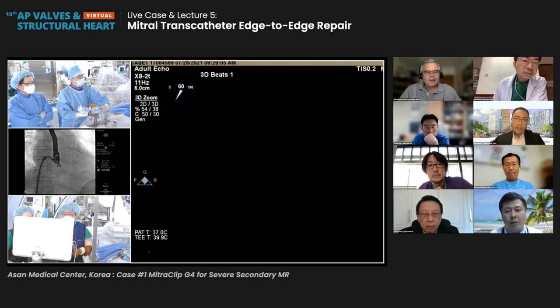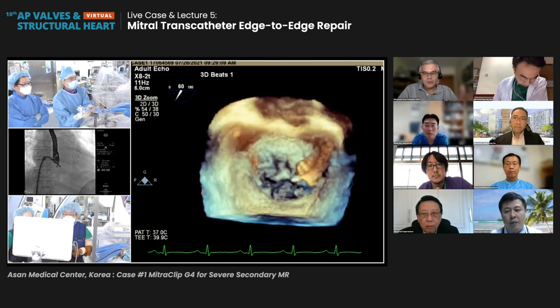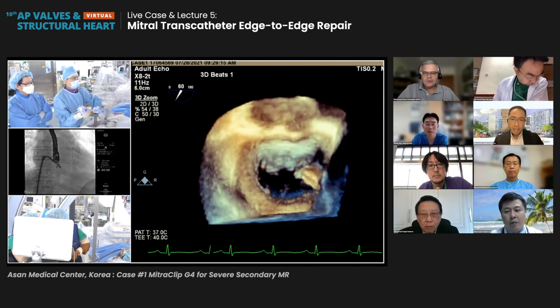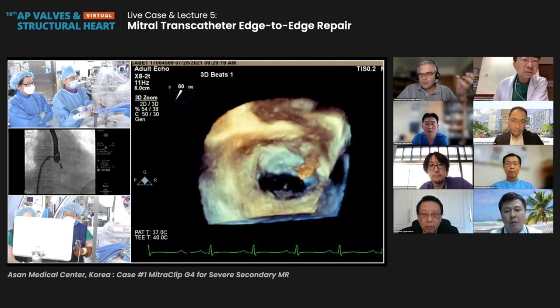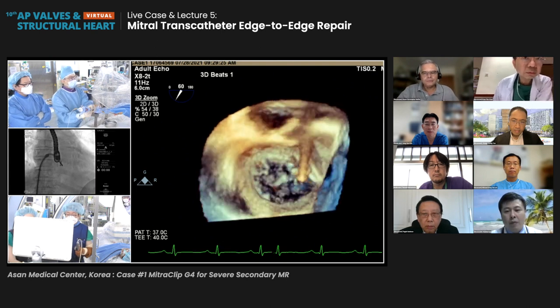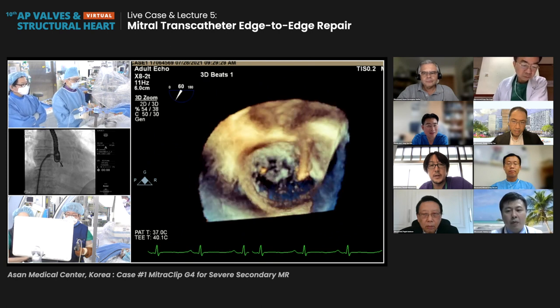I don't know if the other panelists use it as well, but we have recently, once we get the orientation in the atrium, moved the angio so that the two rotated arms clockwise are overlapped. That's good, because often when we dive into the LV, the clip moves a little bit. But if we use the angio, the orientation is quite useful. It's located more medially, but please move it more centrally.